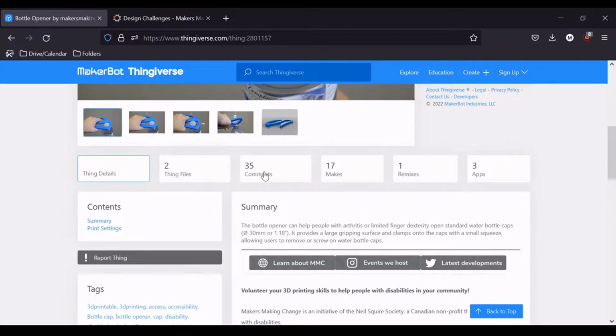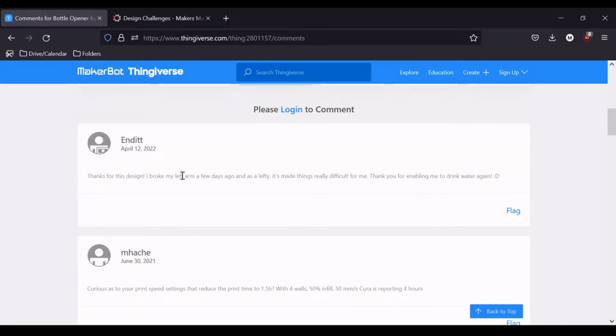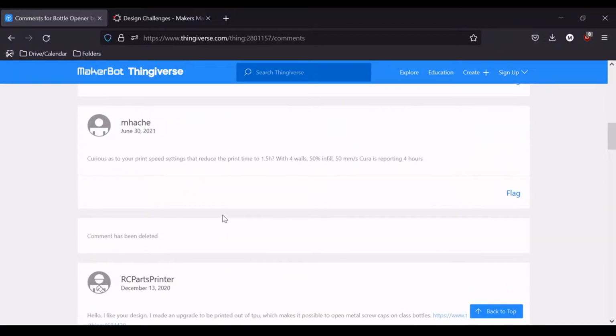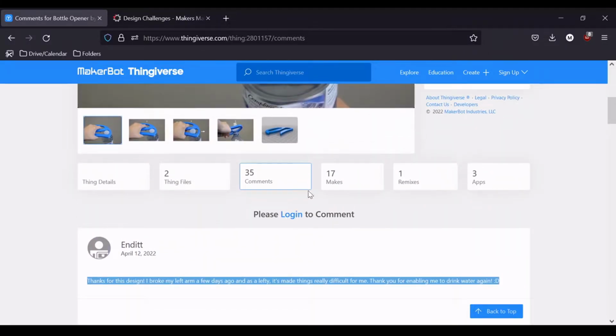Now these tabs up here, this is what I was talking about with that community interaction, the comments. You can see there are a couple of different comments. This might include things like, hey, thank you for uploading this design, or in this case, there's a couple people making suggestions for changing the print settings for faster settings.